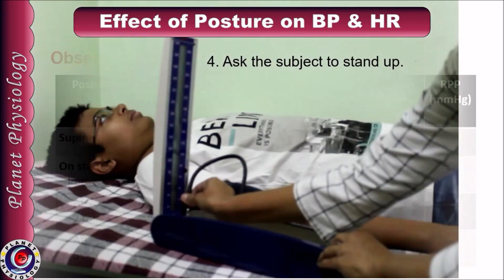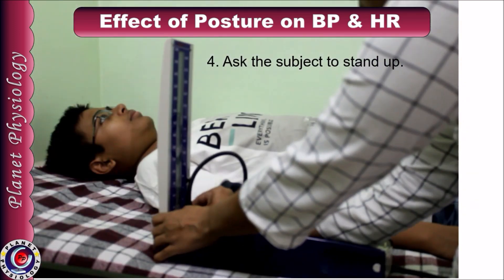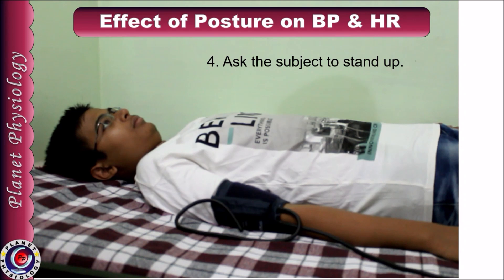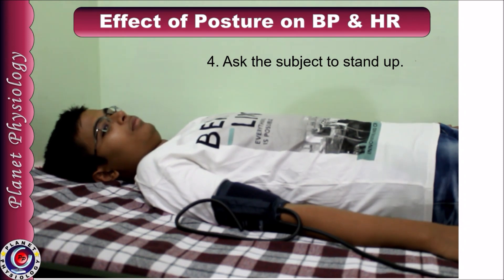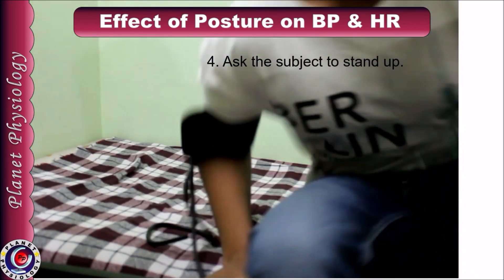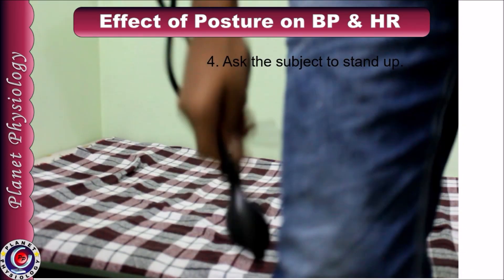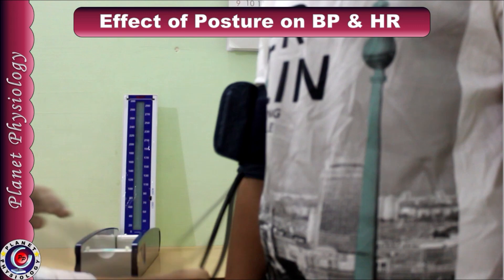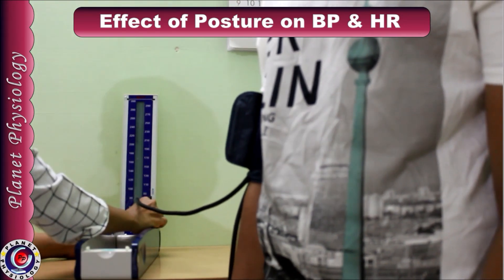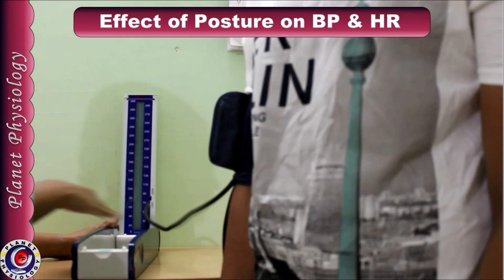Now ask the subject to stand up. So I am detaching the tubing from the manometer. Place the manometer at a height so that once the subject stands up, the manometer will be at the level of the heart. Instruct the subject to stand up. Now attach the tubing to the manometer and immediately determine blood pressure in standing posture by auscultatory method.